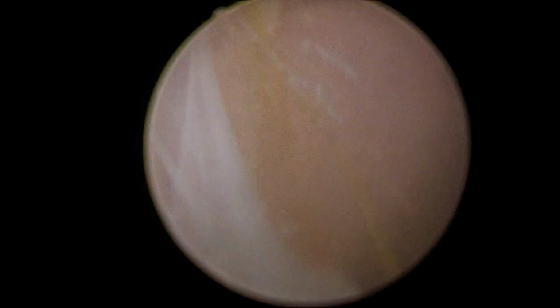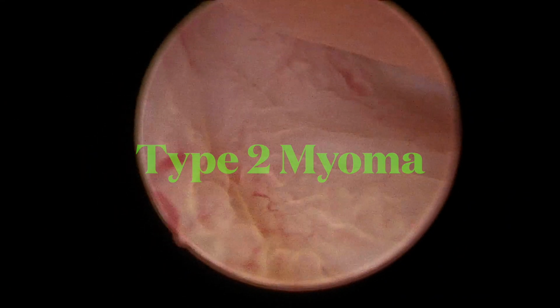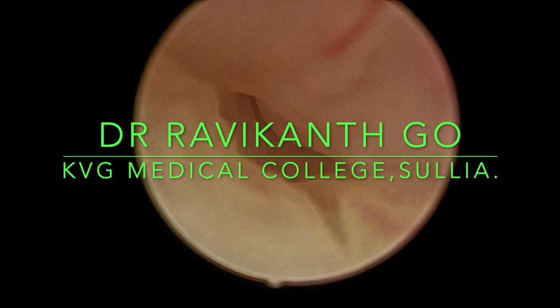Hi friends, I am presenting a case of hysteroscopic myomectomy for a type 2 myoma, multiparous, para 2 living, 34-year-old, presented with dysmenorrhea and menorrhagia. Ultrasound demonstrated there was a 2.2 into 2 centimeter posterior right lateral wall fibroid uterus.